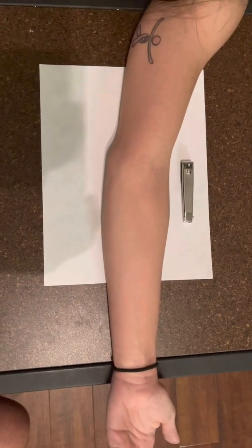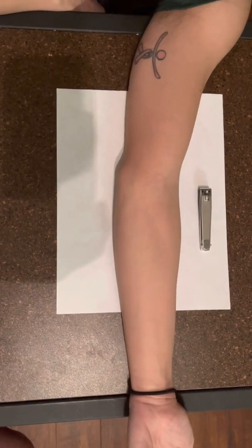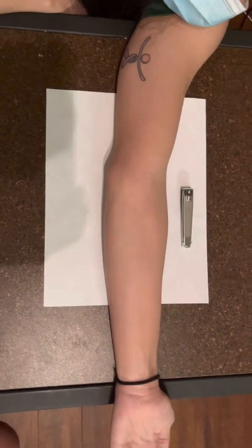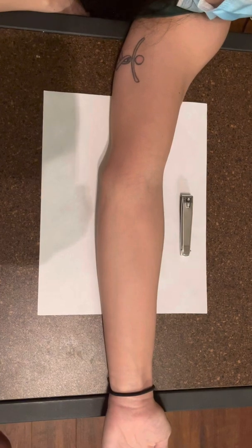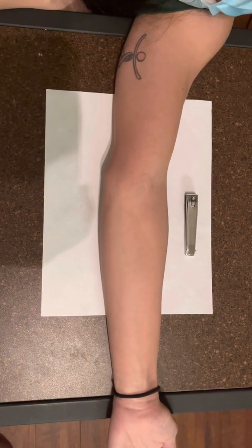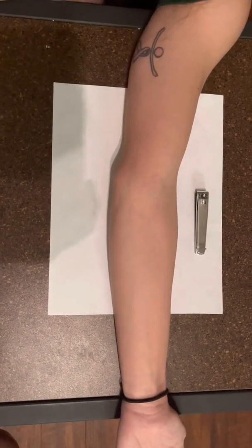For the lateral oblique elbow, the patient extends the elbow and centers it to the center of the field. Externally rotate the hand and arm so that a line through the humeral epicondyles forms a 40 to 45-degree angle with the film plane. The central ray is directed perpendicular to the midpoint of the elbow joint through the center of the field. The anatomy demonstrated is an external oblique image of the elbow. The radial head, neck, and tuberosity are demonstrated clearly without superimposition by the ulna.